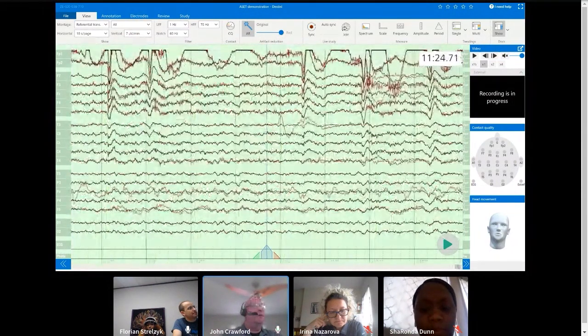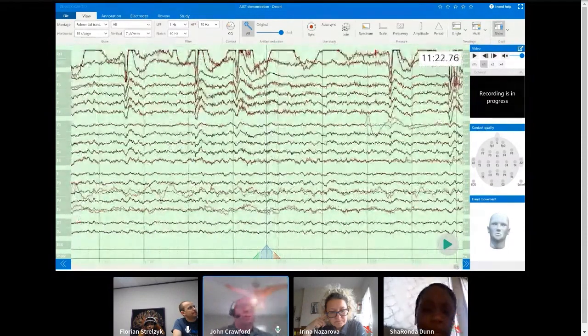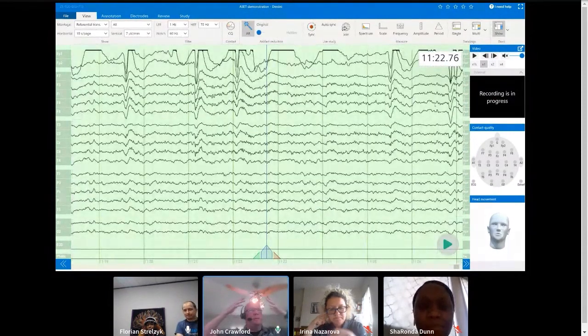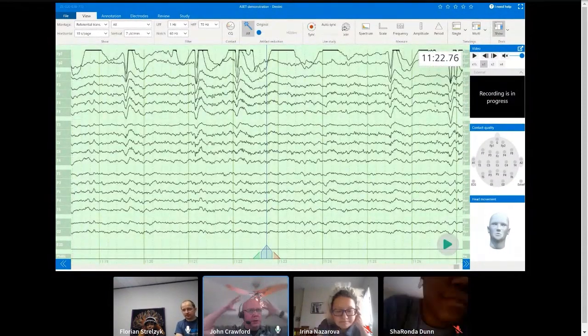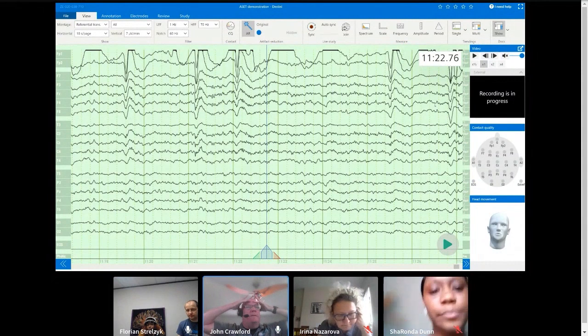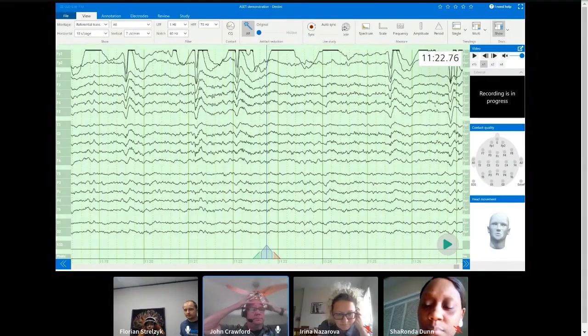If we're talking about micro braids, they come in different flavors, right? There's people that have micro braids that are not very robust, and then we have people with tons. If it's very mild, as long as the headset can sit on and it can touch skin, you're in business. If it's very robust micro braids where there's gaps in the headset, you just feed those micro braids out through the headset just to give yourself room so the headset could sit down onto the skin.